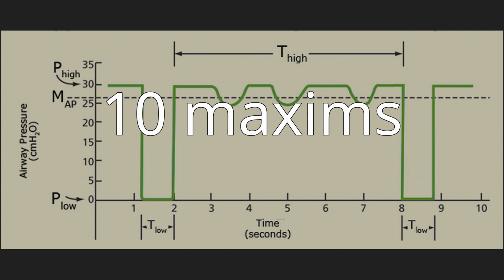Breaths are classified by the criteria that trigger start and cycle stop inspiration. The start of inspiration is called the trigger event. The end of inspiration is called the cycle event. Trigger and cycle events can be initiated by the patient or the machine. Inspiration can be patient-triggered or patient-cycled by a signal representing inspiratory effort. Inspiration may also be machine-triggered or machine-cycled by preset ventilator thresholds.